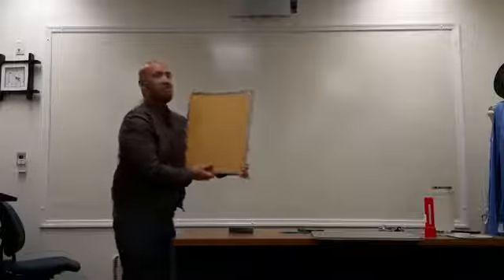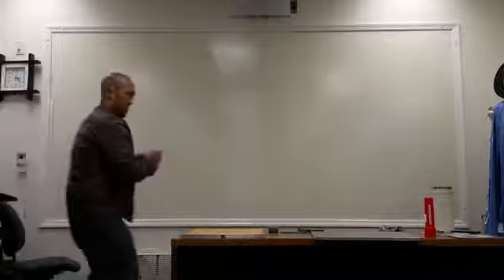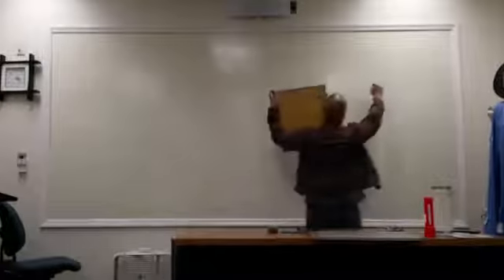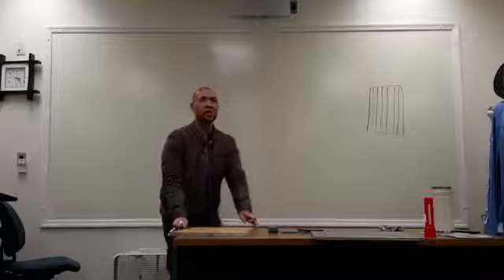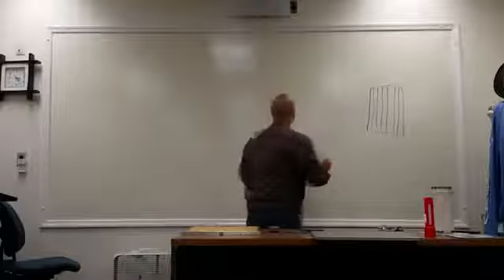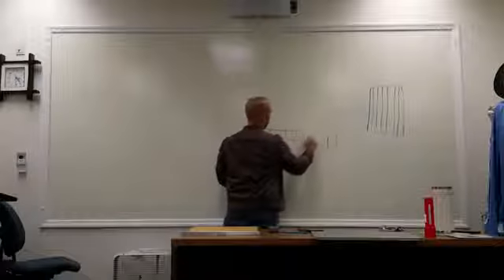So what we're doing here in essence is that if I were looking at it this way, the lead strips will be going down just like this, okay? Very thinly spaced lead. Now, if I were to look at it in its cross section like this, the strips will be coming down this way.